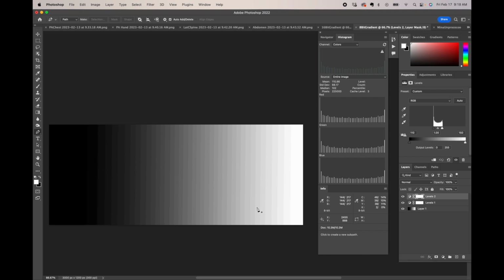Well, where it matters is when you start having to adjust the image. And if you recall, Pascal taught last week about how sometimes, specifically on the portable, the x-ray will come up a little bit at a time, and not the whole image. It'll start at the bottom and start rendering the image on your screen.